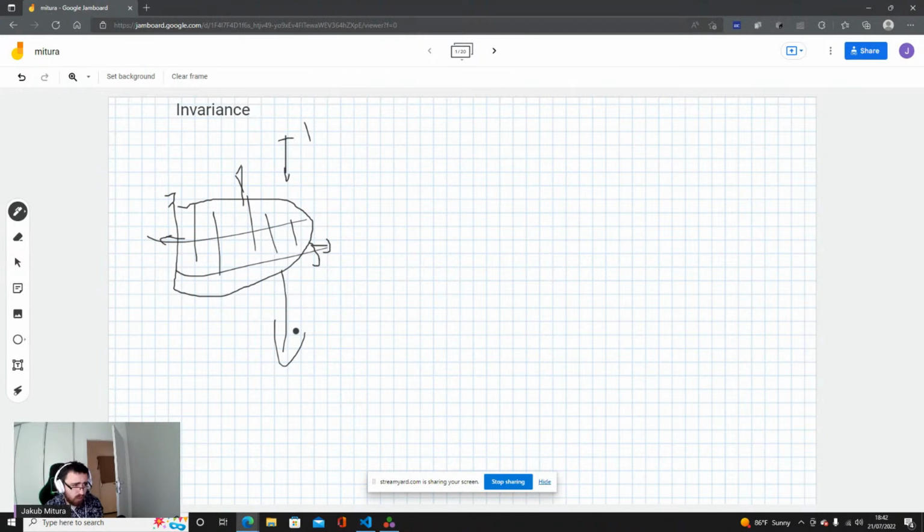At least in principle. But if we look, for example, at a nodule in the lung, it can look basically the same whether we rotate it or not. In some cases, switching the intensity is important. For example, in the suprarenal glands, intensity is quite stable and typical for the disease. So shifting the intensity will lose the information.